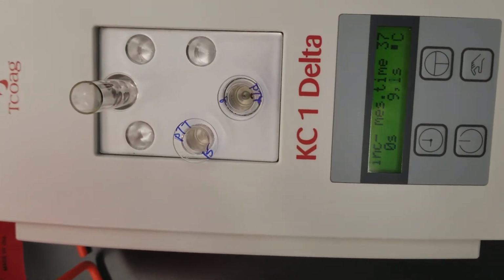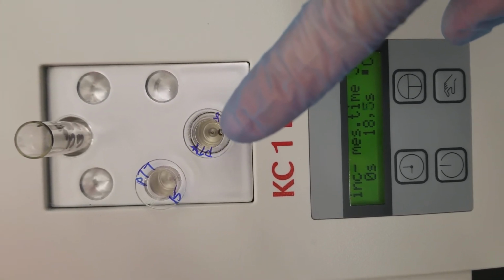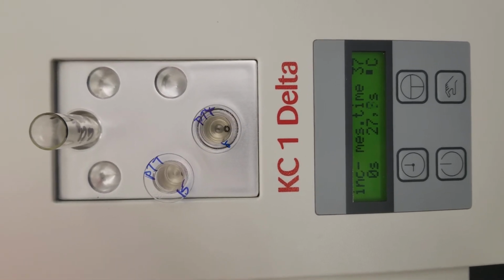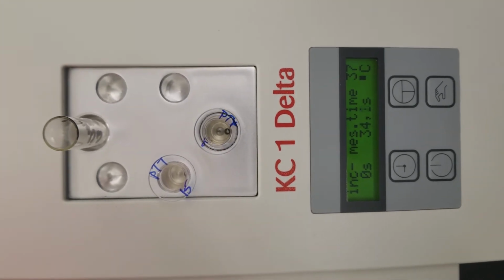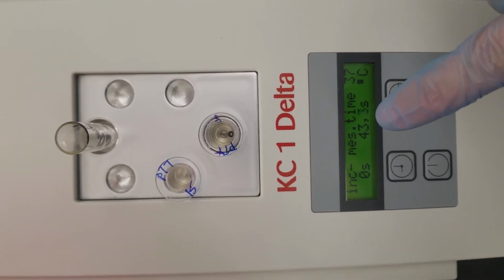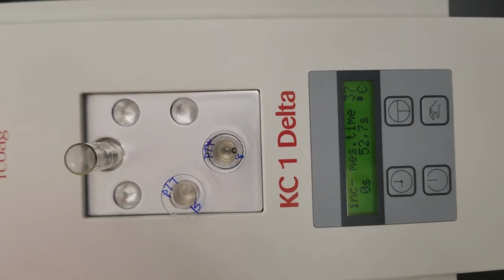Let's watch this really quick. Okay, so see the ball is still moving because it's in the same spot where that magnet is, the magnet inside the analyzer. When the viscosity changes and it clots in the cuvette, that ball is going to start to look like it's moving, but it's not actually moving. It's going to be still because of the viscosity. Okay, so the time is still running. We're doing PTT. So know that the PTT critical result is 100 seconds. This should actually give us like a 70 something.